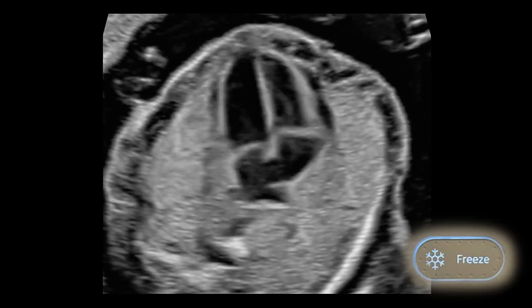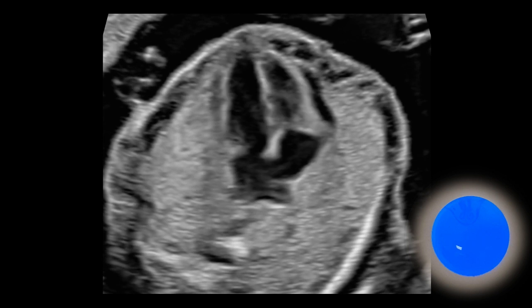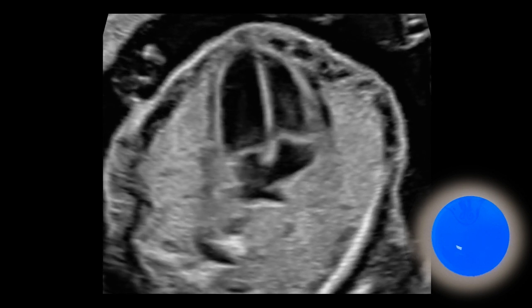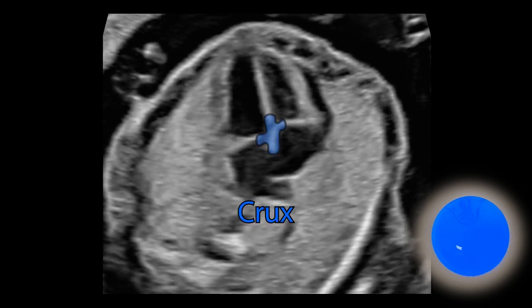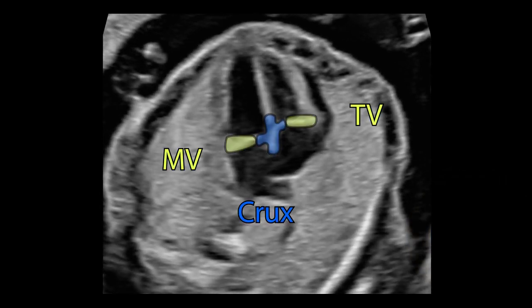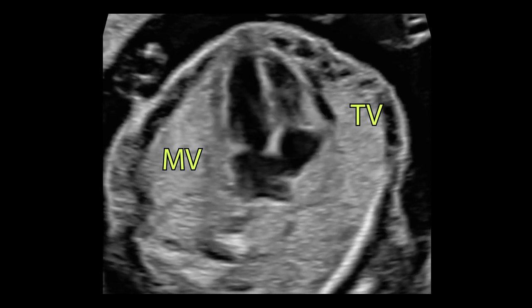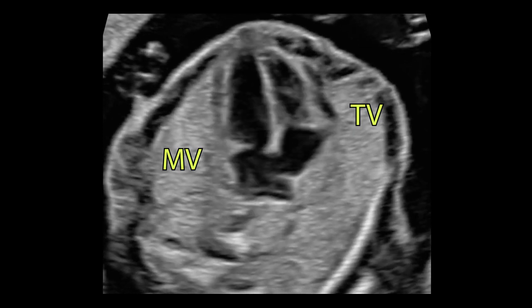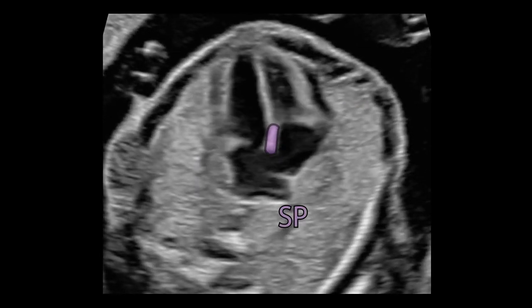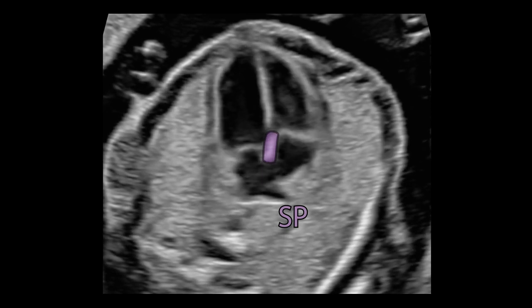The cine-loop function is an excellent tool to evaluate the crux of the heart. The tricuspid valve is slightly more apical than the mitral valve, and both AV valves are implanted separately. They open and move freely. The small interatrial septum, septum primum, is visible.